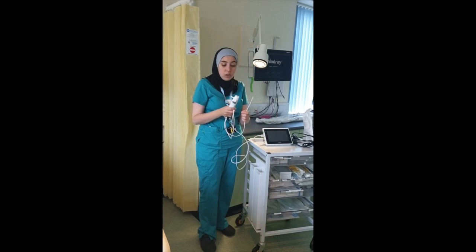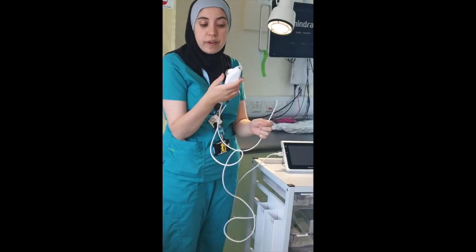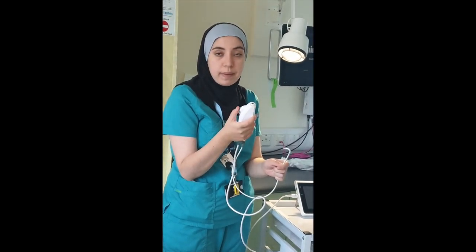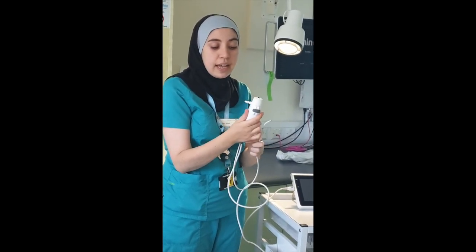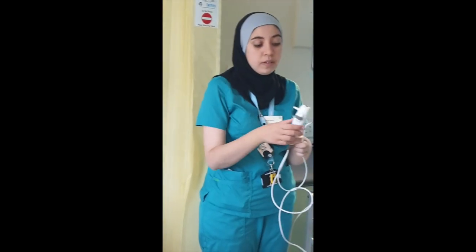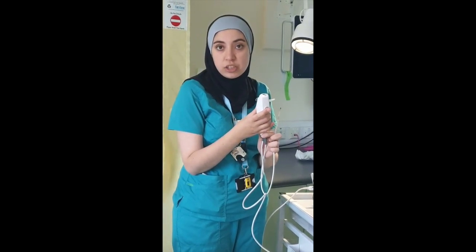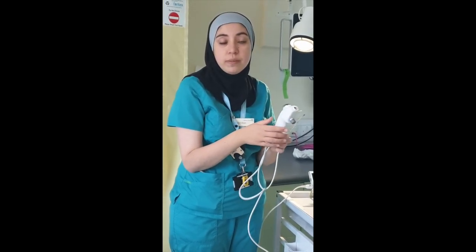On the actual scope, you can see that there's a lever here. This lever is very important because it allows you to move the end of the flexible bronchoscope, as you can see here, during your bronchoscopy. On the side, you have a suction port, and this attaches to the suction. And you have a button here which is pressed in order to activate the suction. At the top here, you've got a port which can be used to instill saline if required, depending on what you're doing with the procedure.